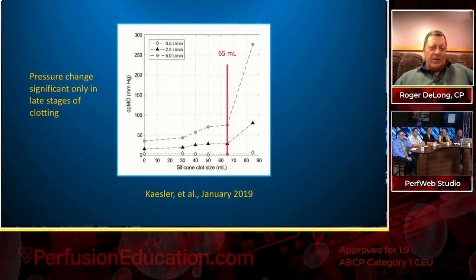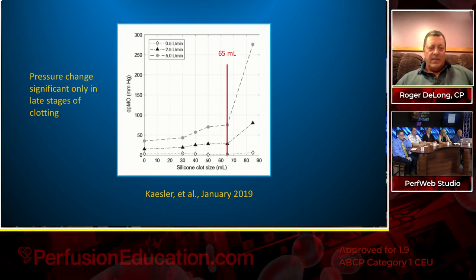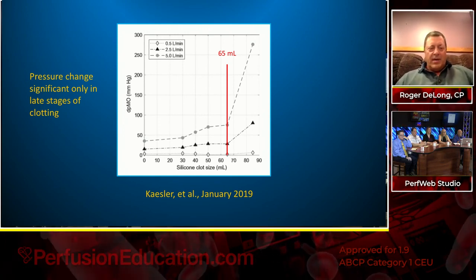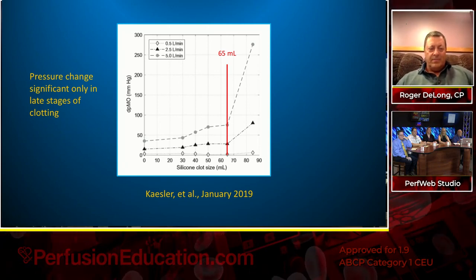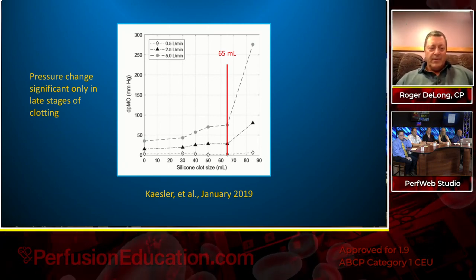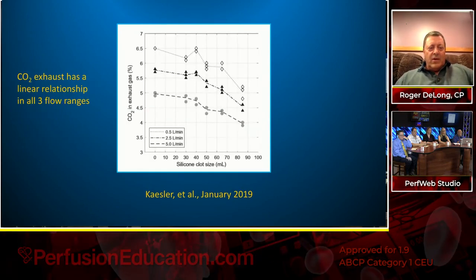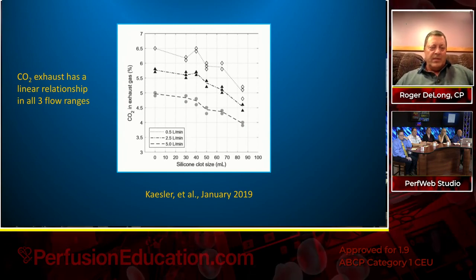Troubling to the pediatric perfusionist here, if you're running 500 cc's in this case, even beyond that to the 85 and beyond, you're not going to see a rise in pressure upstream. So the late sign won't occur until significantly later. Next. And next.